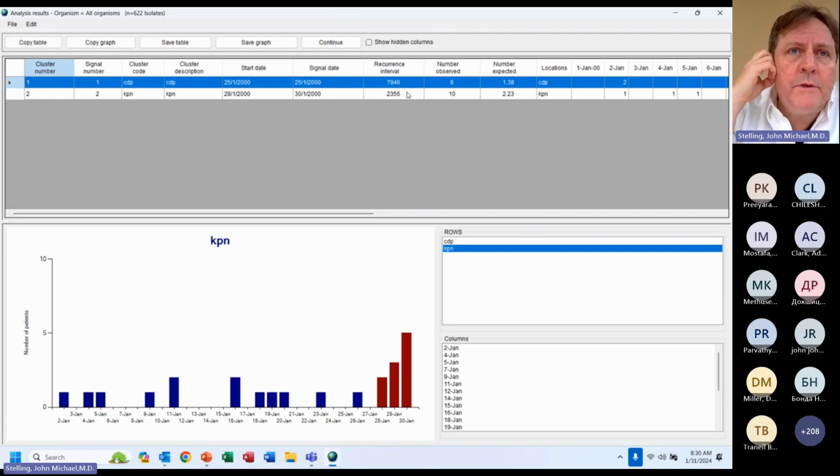We do use the p-value as our threshold for retrospective analyses because it's a simple one analysis. So anything below 0.05 could happen by random chance 1 time out of 20 experiments, but we only did the experiment once.